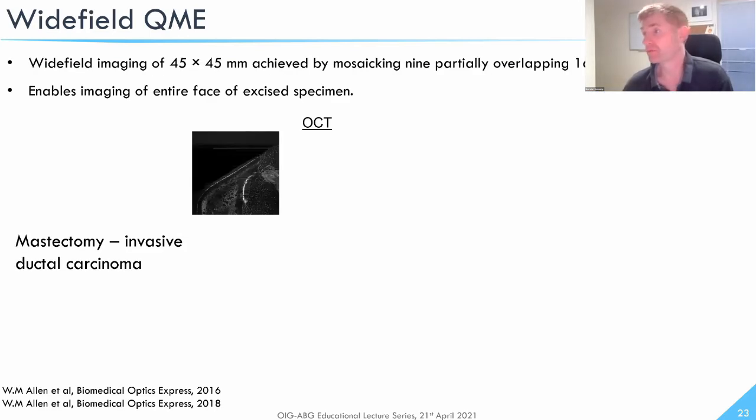So we thought, tumor is known to vary the stiffness of tissue. This application requires micro scale measurement of stiffness, and also the limited penetration depth of OCT is not really an issue here, because large meta-analyses in breast cancer have shown that once you can determine there's no cancer within around 1 millimeter of the excised specimen, if the patient gets radiotherapy, that's sufficient to deem the margin clear. So what we did, we need to scan large regions of tissue, ideally centimeters wide.